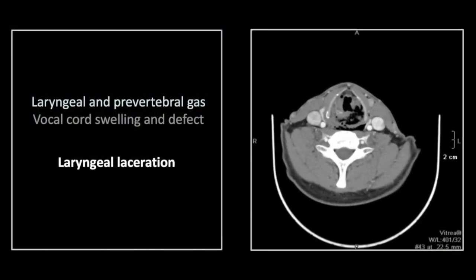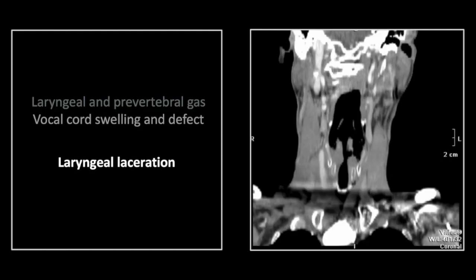Our next case is a laryngeal laceration. There is a good deal of prevertebral soft tissue gas. Right here at the posterior lateral aspect of the glottis, you can see a defect allowing that gas to escape. Here on the coronal, the location of that defect is more precisely defined — it is essentially in the laryngeal ventricle. The cords on the opposite side are significantly swollen and distorted as well.